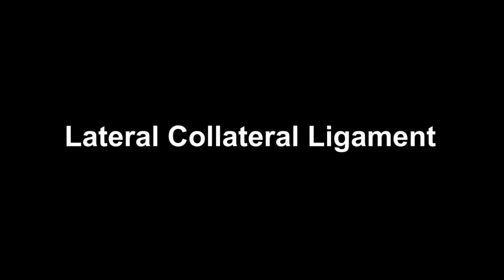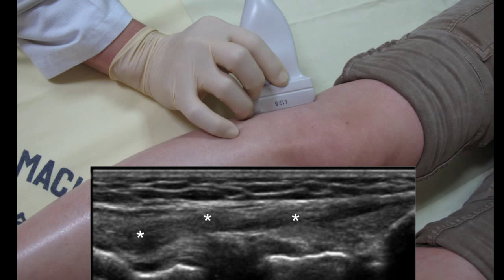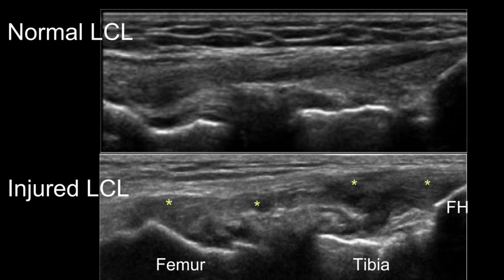The lateral collateral ligament lies between the apex of the fibula and the lateral femoral epicondyle. This ligament's properties and its oblique orientation make it hypoechoic under ultrasound. Lateral collateral ligament injuries are much rarer than medial collateral ligament injuries. An injured lateral collateral ligament appears under ultrasound as thickened and/or uneven, or as a disrupted band.